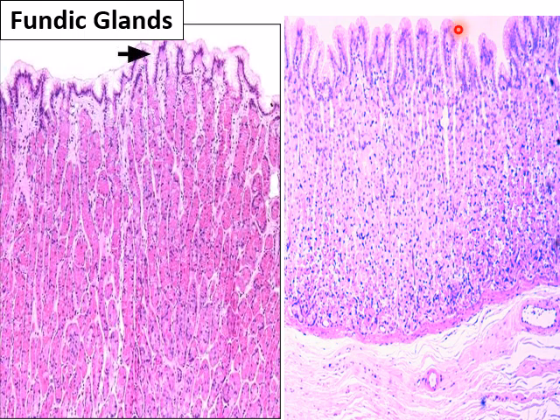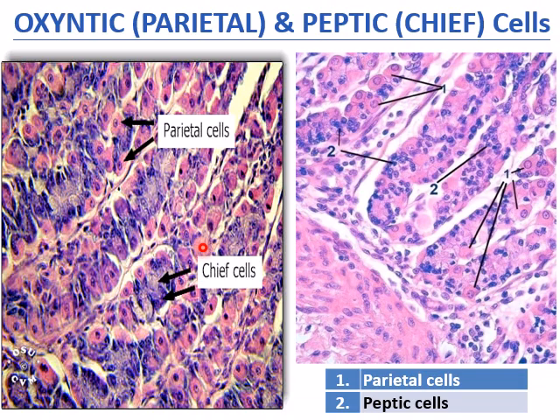Shallow, narrow pit, and these are the glands which are crowded, and I can see dark acidophilic and dark basophilic cells. The dark basophilic cells, which are the peptic cells, I can see in the lower part of the gland. And this is the muscularis mucosa, and this is the submucosa. Dear students, this is a very nice photo. It is a light microscopic picture.